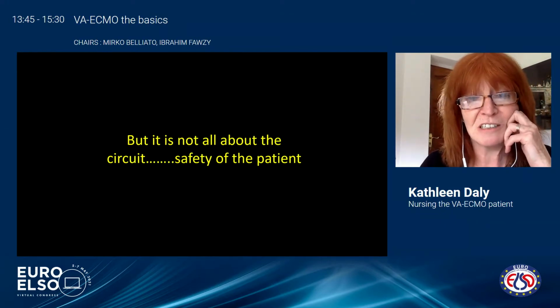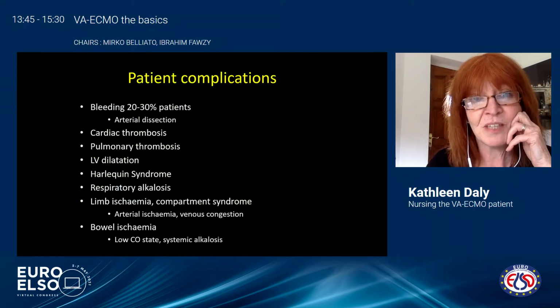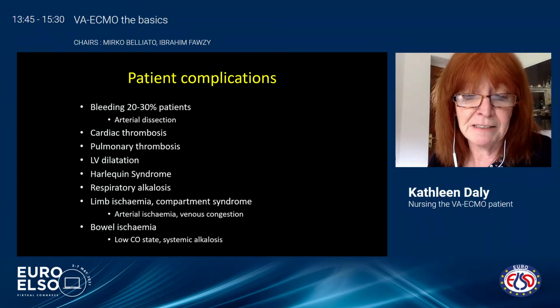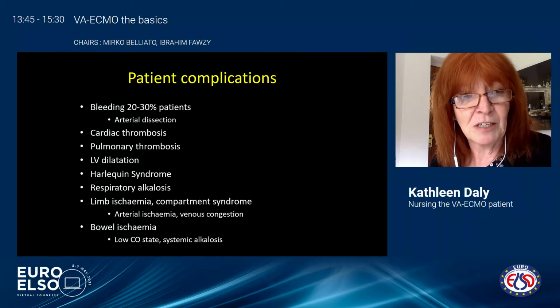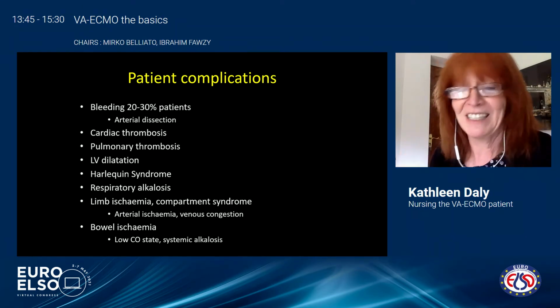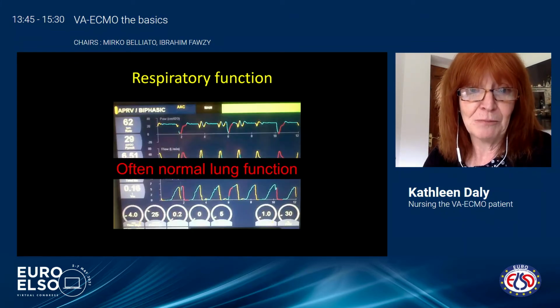But it's not all about the circuit, is it? We've also got to consider the safety of the patient. And as was pointed out earlier, patients on VA ECMO have many complications, including all of those listed here. And it's our responsibility as the ECMO nurse at the bedside to know about the potential complications and to recognise them and manage them, hopefully, before they occur.